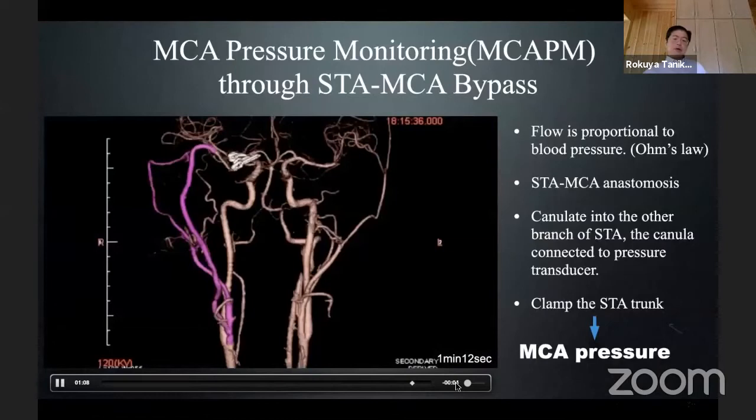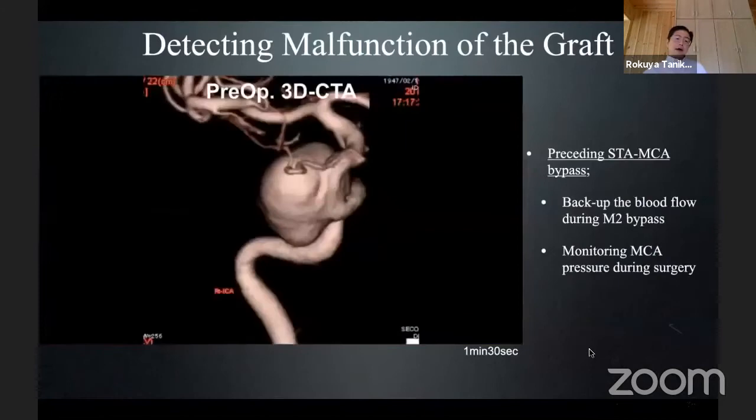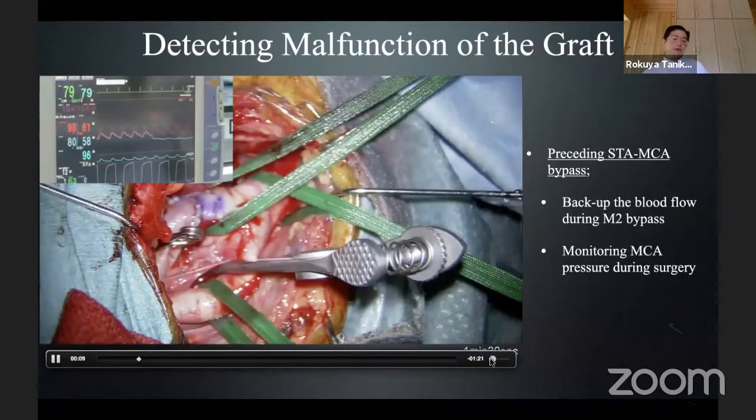ICG shows good condition as well. This is an example of MCA pressure monitoring through STA-MCA bypass by clamping the STA trunk. Now I will show you an example of malfunction of a bypass graft under MCA pressure monitoring.